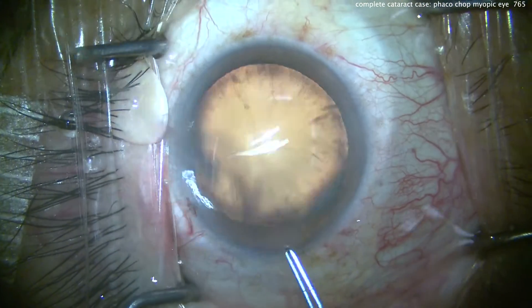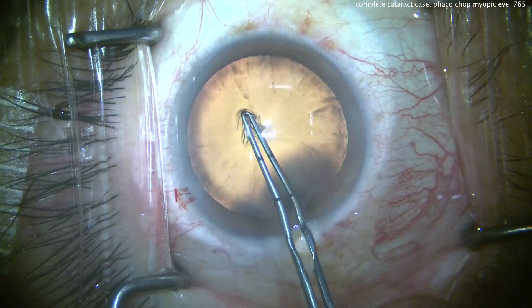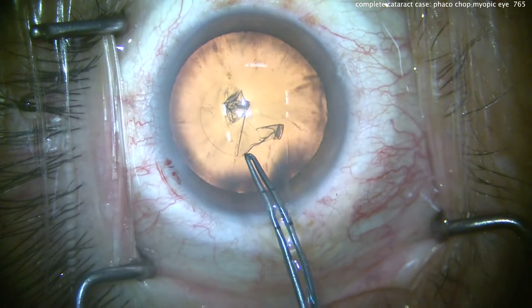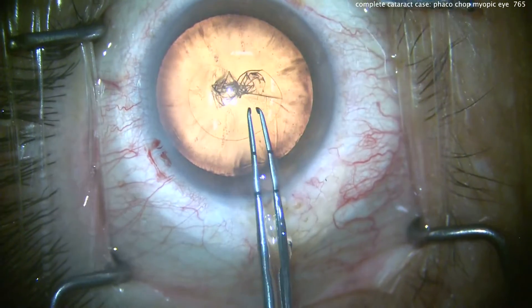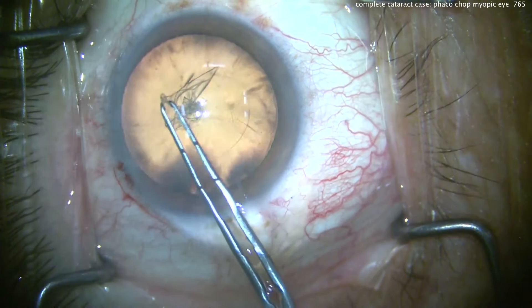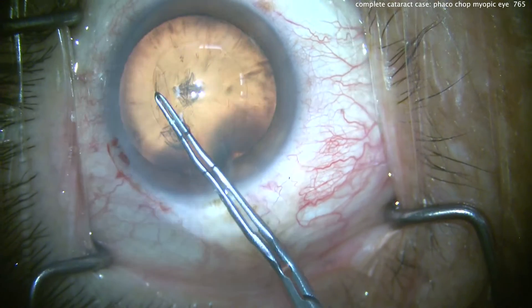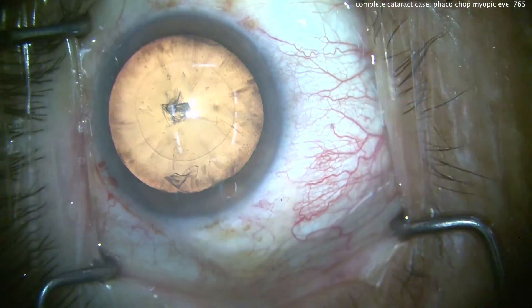And now for the capsularexis. It's very important to use the marks on your forceps tips in order to create an accurate capsularexis. Remember, all of our IOL optics are 6mm in diameter, so we want to create a 5 or 5.5mm capsularexis, even in an eye like this that's quite large. Don't make an overly huge capsularexis, because that may not overlap the optic. That looks just about perfect. Notice how we've centered it on the Purkinje images, and we can measure it — it's just about 5 to 5.5mm.